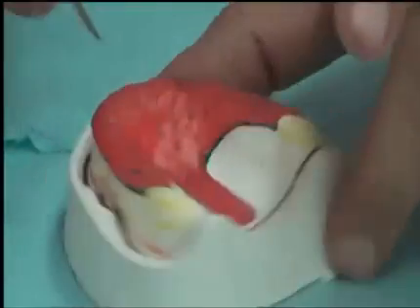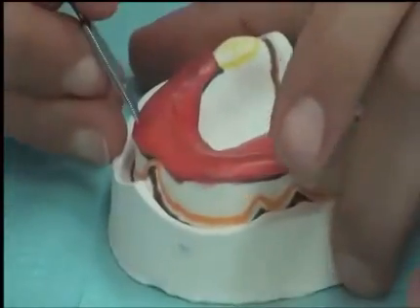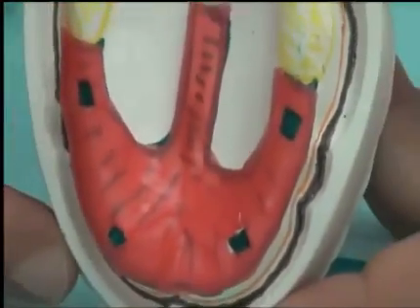So the tray material will stop here, maintaining the space. And this is the partial relief for the upper.